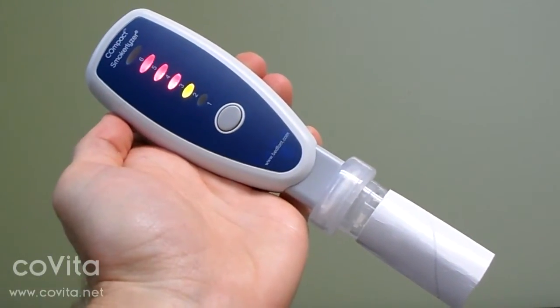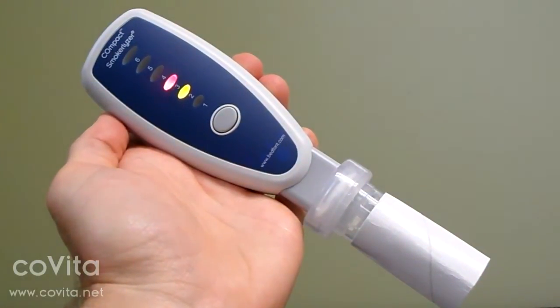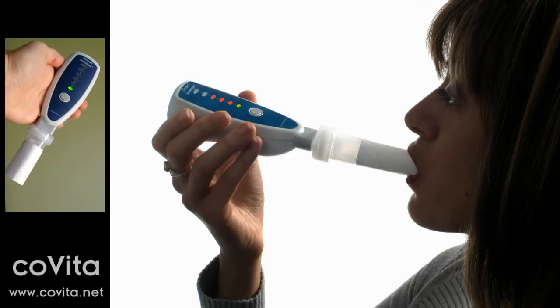The countdown begins starting from the top and you'll notice each LED flash three times for three seconds. When the number one green LED flashes, instruct the patient to place their mouth over the cardboard mouthpiece and exhale — a steady and slow exhalation is best.